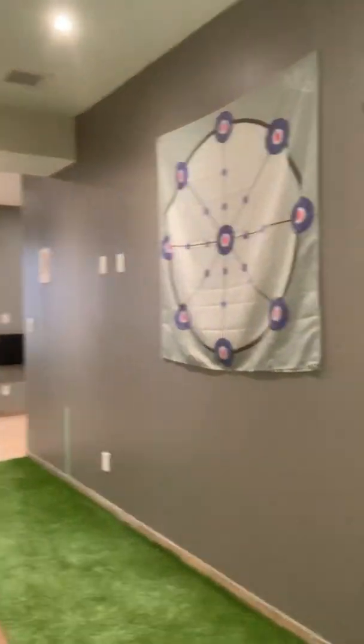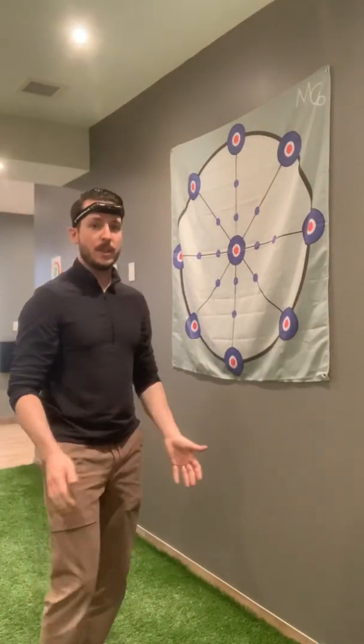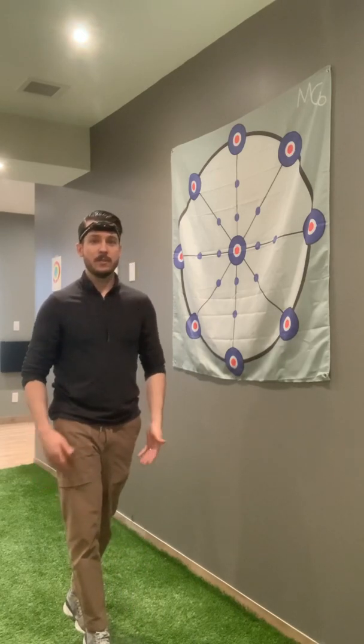Here we have a target that's almost just like a clock. We stand a set distance away from the target — you can go further back to make it more challenging. Just like balance training, we can alter our foot position to make it more difficult: feet shoulder-width apart is a little easier, feet together or one foot in front of the other are ways to progress it, and we can also move to an unstable surface like a Bosu ball to make it even harder.